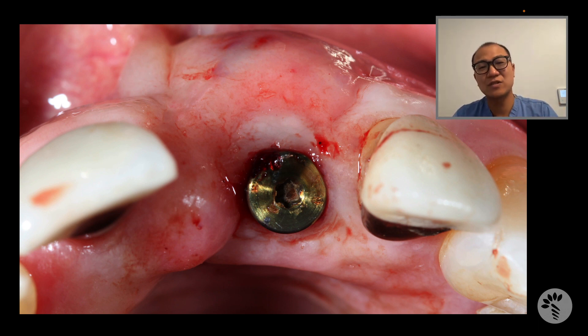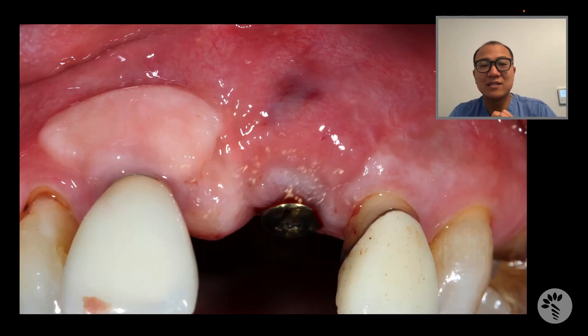The tissue is now more convex as opposed to concave, and because the tissue went inside as a layer, aesthetically it's not going to be as unaesthetic as the free gingival graft on the other side. You can clearly see there is almost a bulging of the buccal tissue, but aesthetically it looks totally acceptable because there is no graft showing on the outer layer.